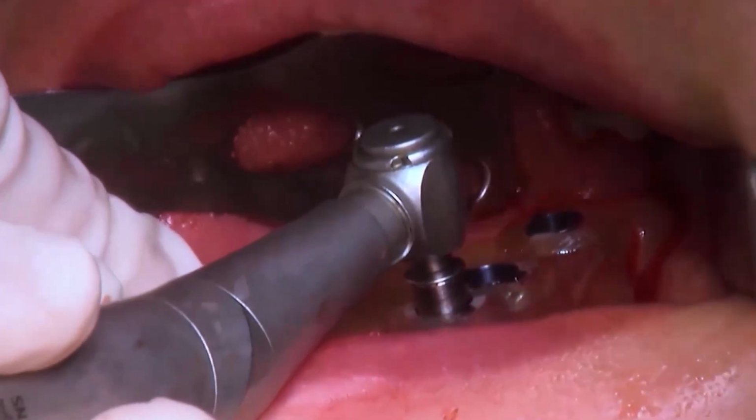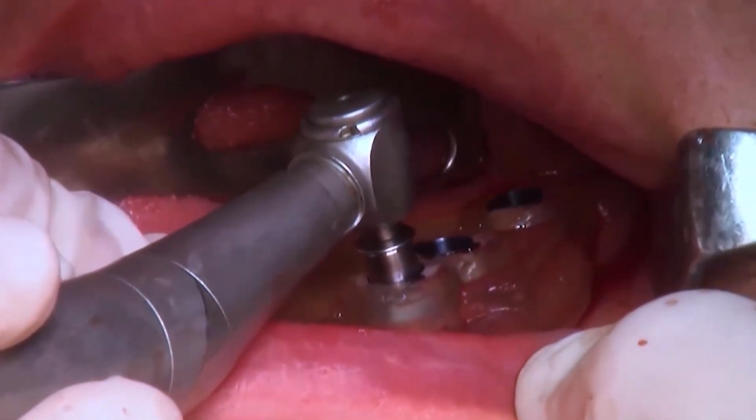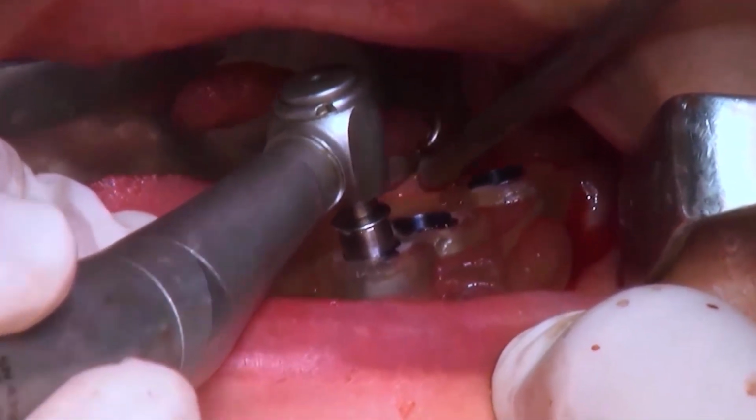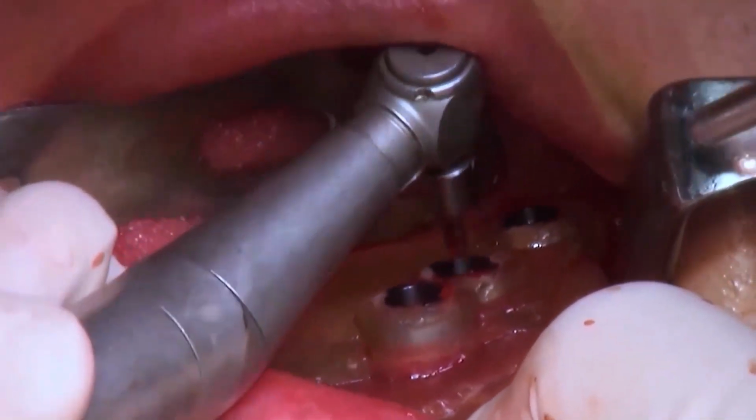The drilling on the other side is being done using the same drill sequence as on the previous side.